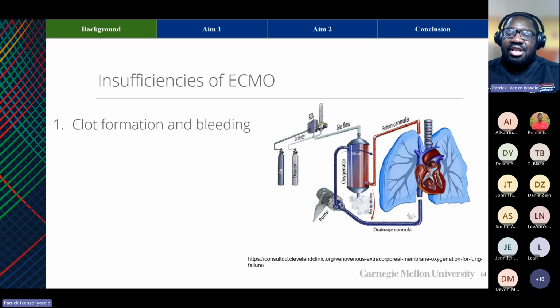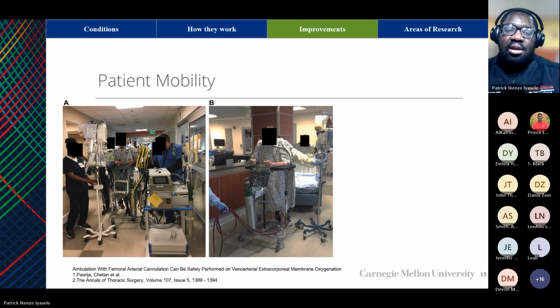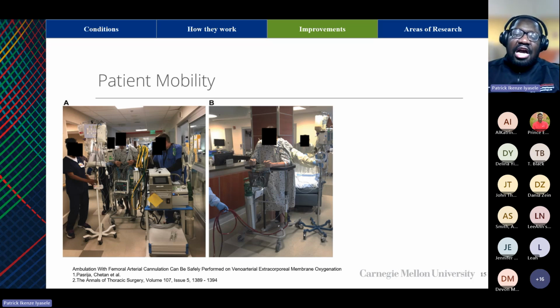The second major issue in implementing long-term ECMO is the limiting of patient mobility. Patients have limited movement in the ICU while being treated, and neuromuscular weakness is common when immobilized during critical illness, and physical movement is associated with shorter hospital stays.